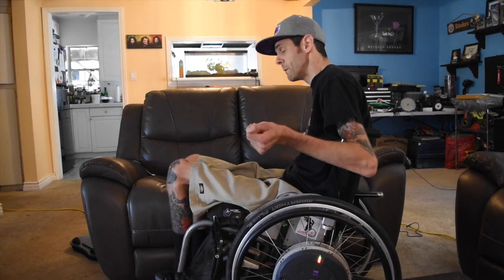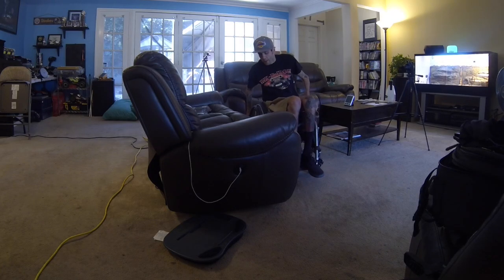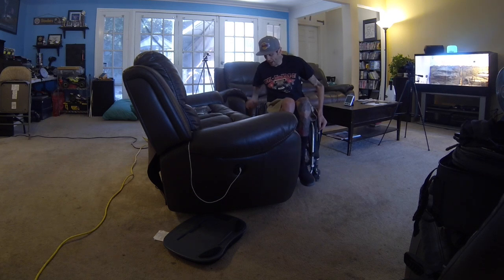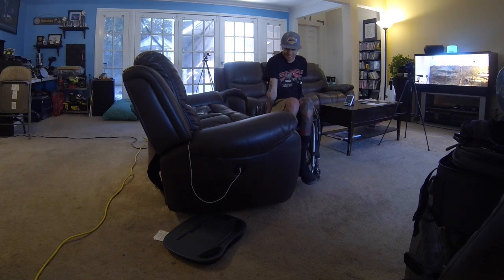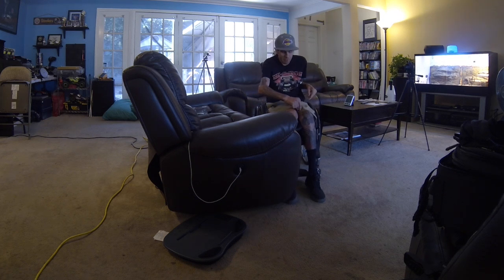Alright, so same thing, I'm just gonna pull up. I'm gonna use my inside wheel and get a nice angle where I have contact with both the front of my wheel here and the front of my caster on the lead side. So same thing, I'm gonna pop my legs down. I usually always just adjust my shorts a little bit, just because I don't like them to bunch up, and the more transfers you do, the more they wedge up and you got all kinds of pants up your butt. So no, it's not cool.